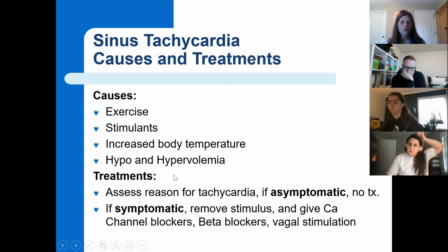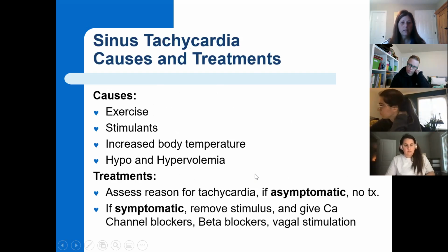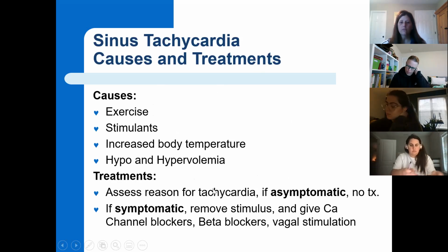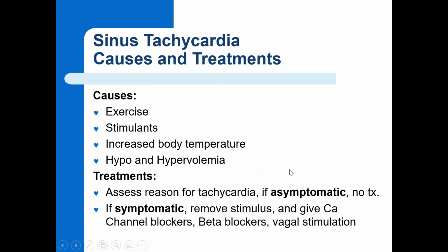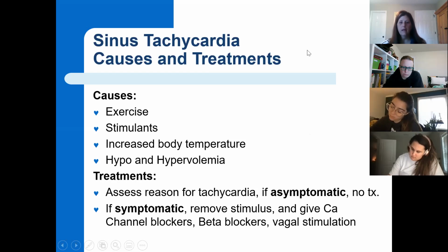So again, some things you can read here on your slide, some causes and some treatments. Again, figure out the reason for the tachycardia. If the patient is asymptomatic, we're not going to do any kind of treatment. We're going to continue to monitor. If they are symptomatic, you see the things here on the slide that you might do. You may see sinus tachycardia if the patient is going through alcohol withdrawal or if they are currently intoxicated. So that's a possibility. But again, if they're asymptomatic, we're just going to continue to monitor.